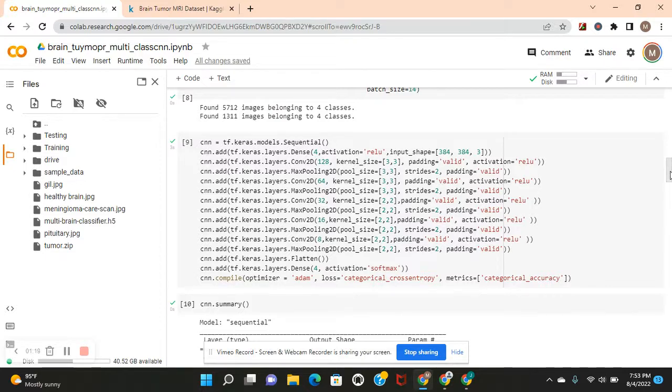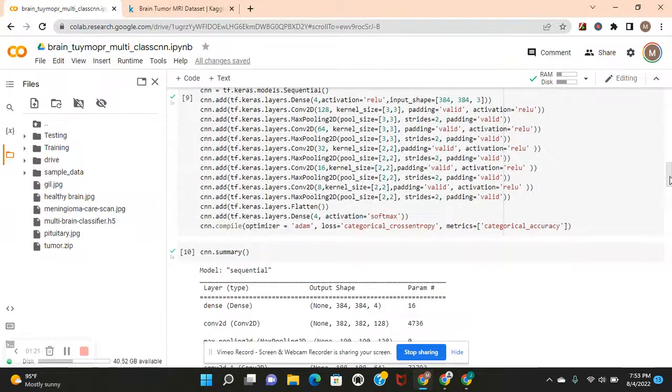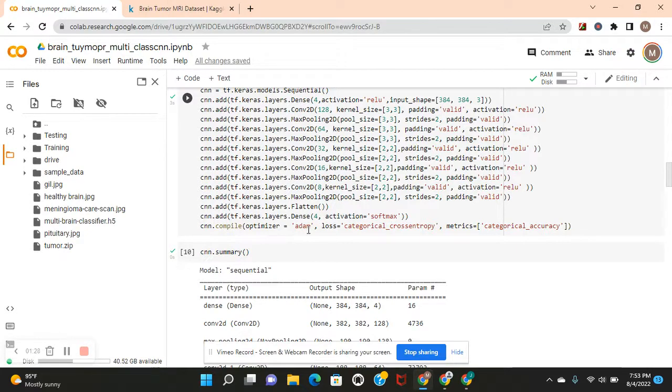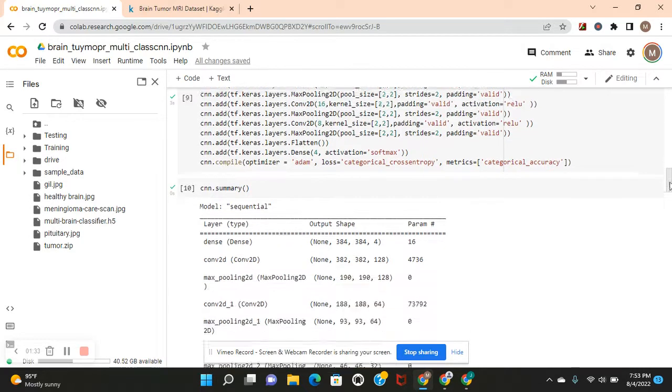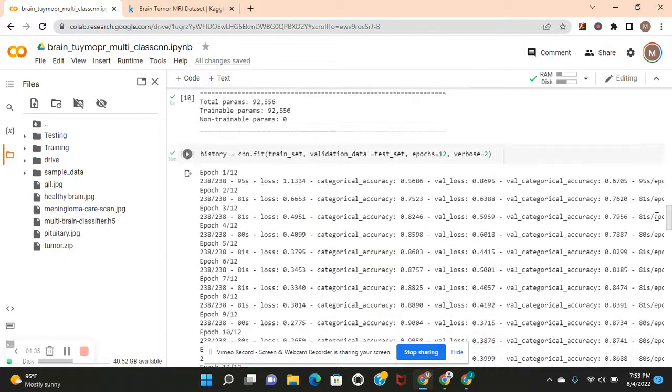Max pooling is used to prevent overfitting. Dense 4 after flatten, activation equals softmax. If it were binary, we would do sigmoid. Optimizer Adam, categorical cross-entropy and categorical accuracy. See the summary.